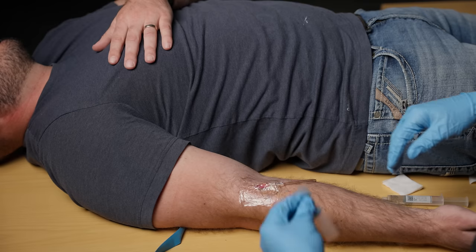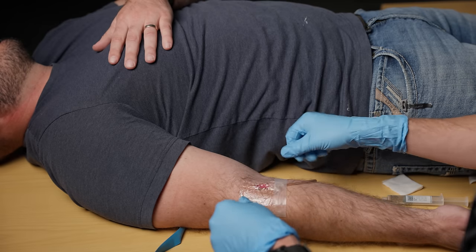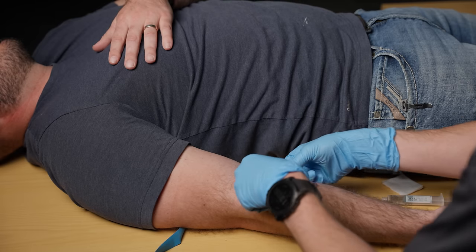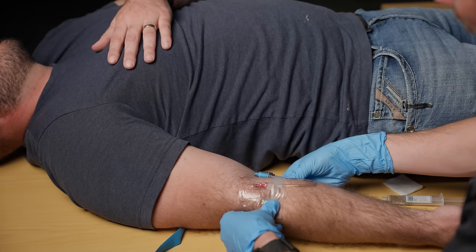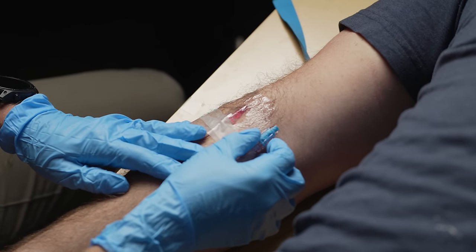Then finally we're going to use our tape. The easiest way is just take this tape, lay it over the top, take a second piece and tape the hub facing up the arm just like this. And now we can use this port to give meds anytime we want.